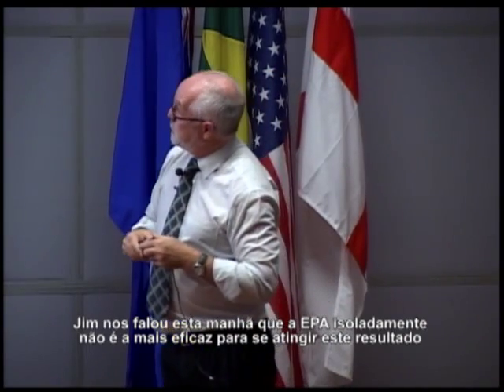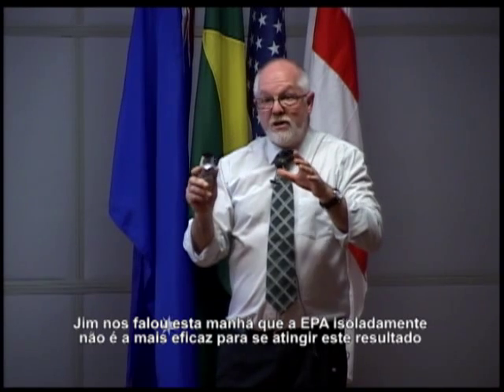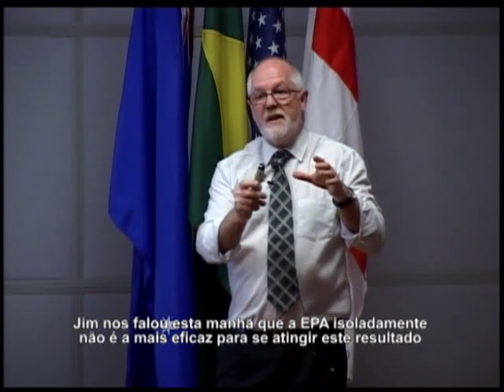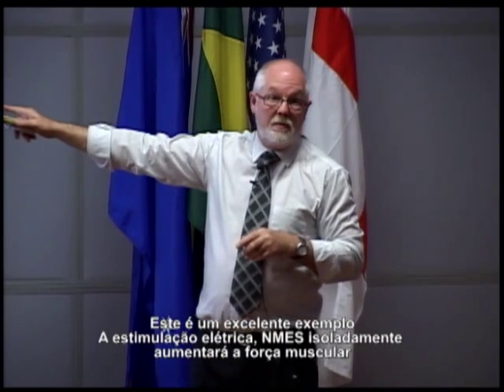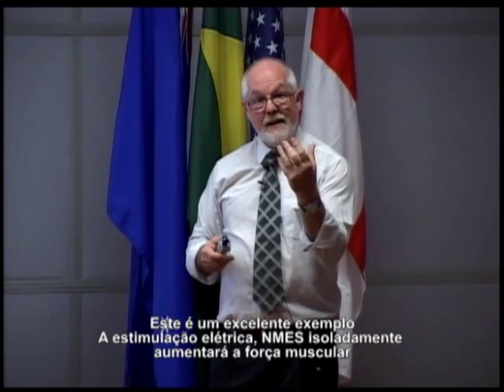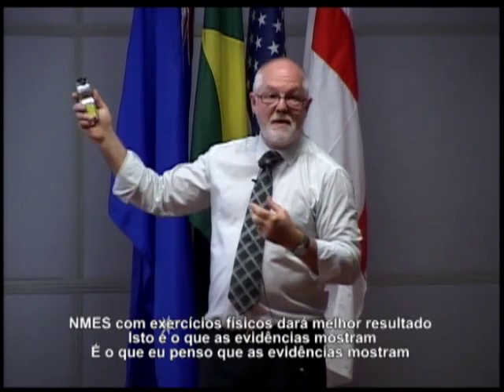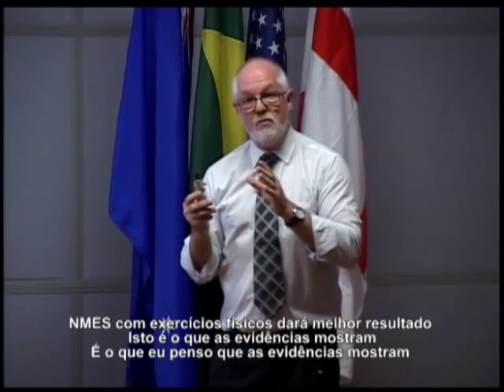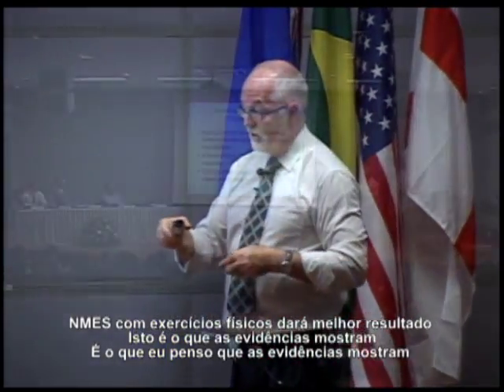And we were hearing this morning from Jim that EPAs in isolation are not the most effective way to achieve results. This is a great example. Electrical stimulation, NMES, in isolation will increase muscle strength. NMES with exercise gives you a better result. That's what the evidence says. That's what I think the evidence says.